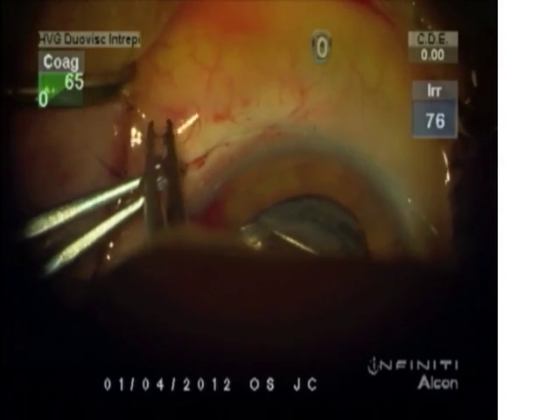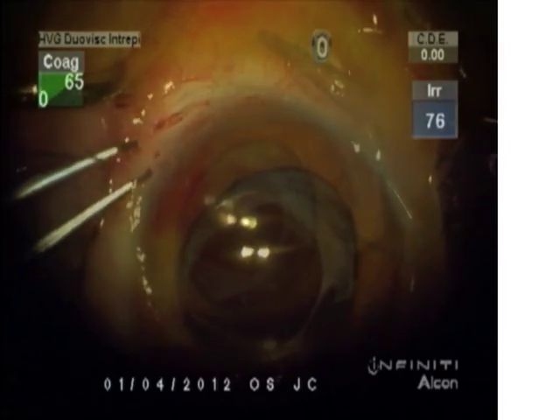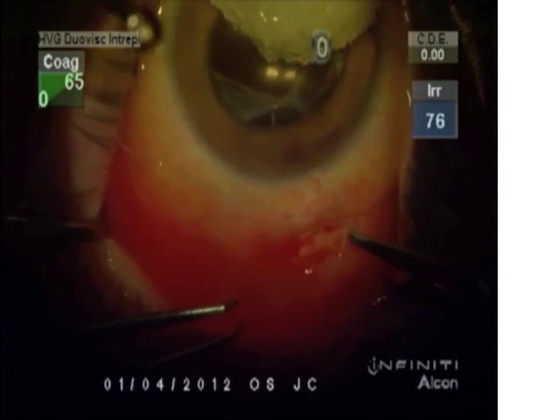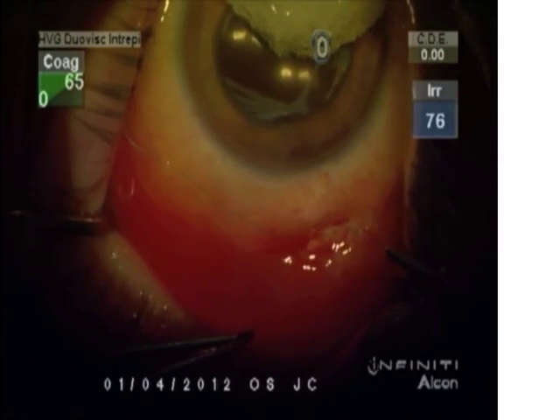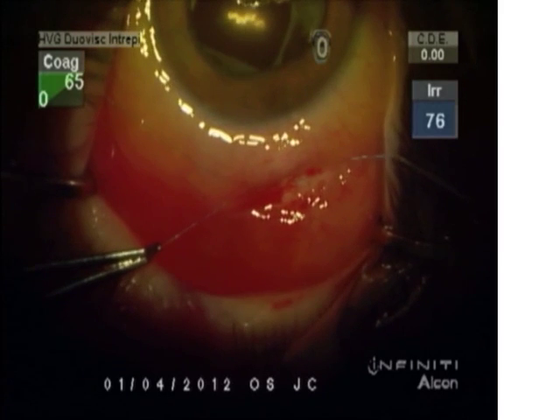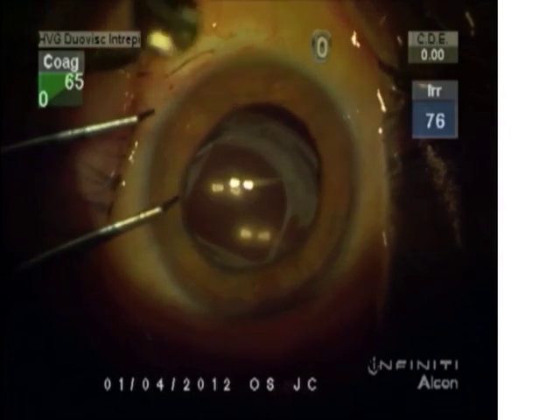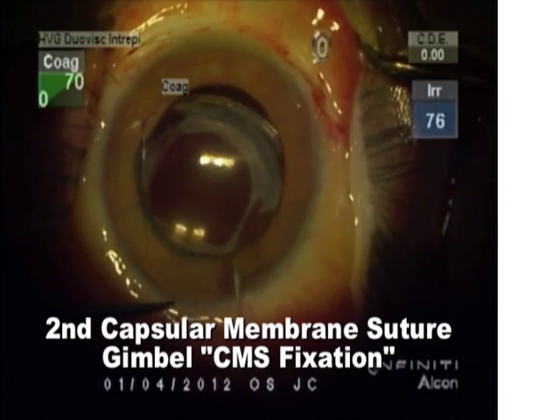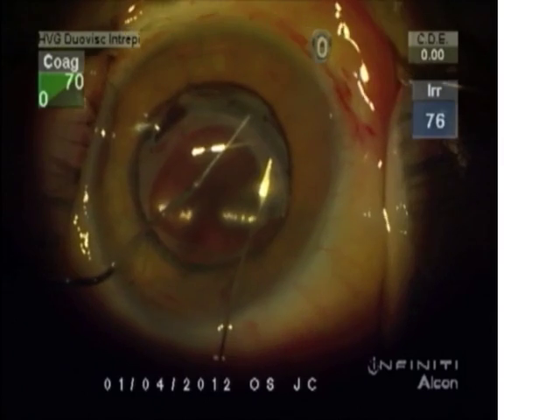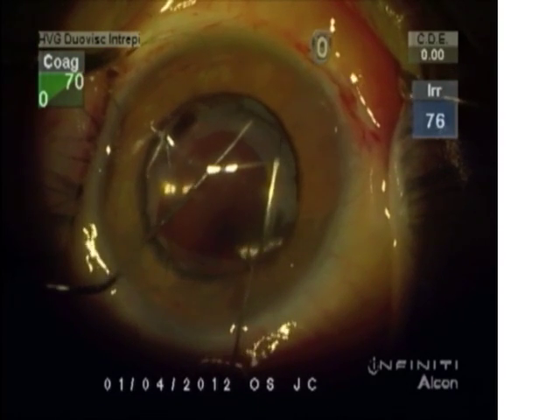This technique allows for perfect centration because if this suture does not center it perfectly, we can add sutures anywhere and in any number to achieve perfect centration of the bag IOL complex. The double throws did not hold under that tension so we're tightening again. We can see the lens is a little decentered inferiorly, so I'm going to add a second capsular membrane suture at about the 10:30 o'clock position to achieve perfect centration.